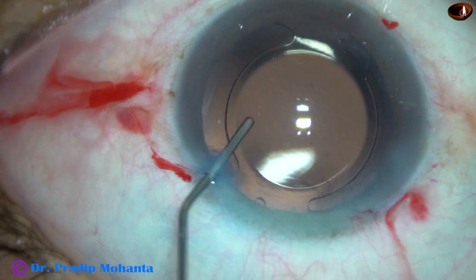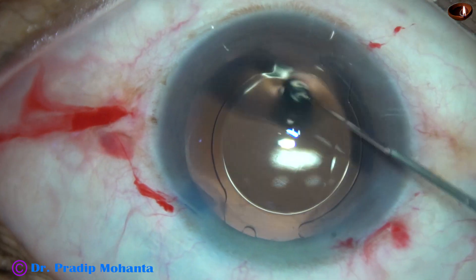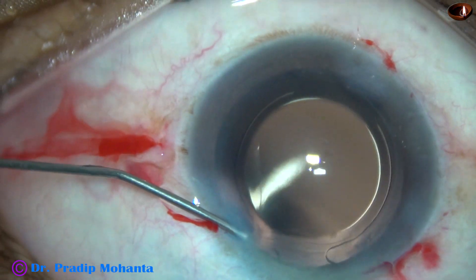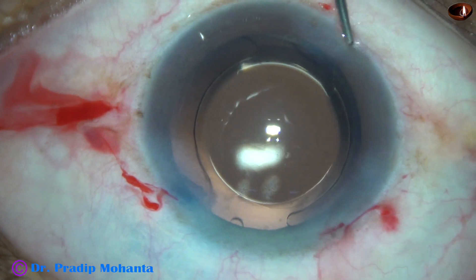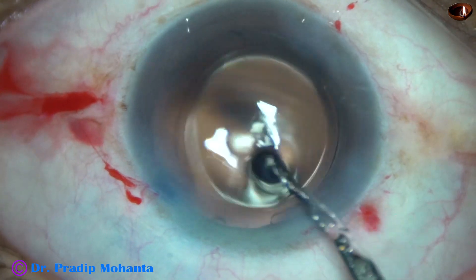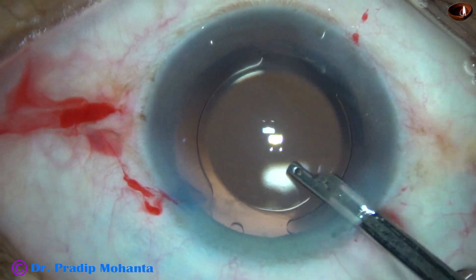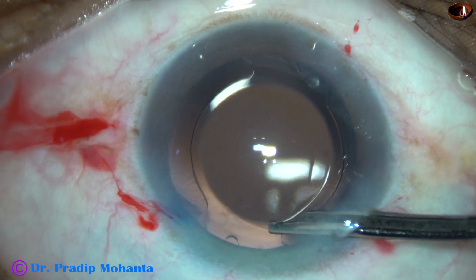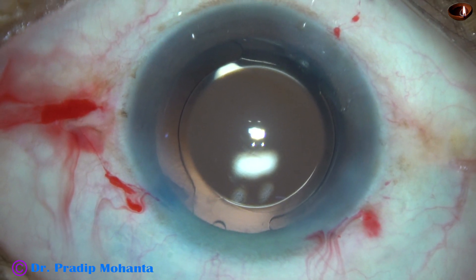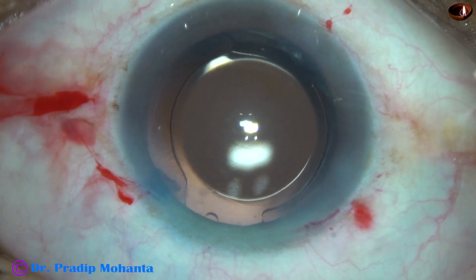And now this is a bit of moxifloxacin. The side ports are closed by hydrating the corneal stroma with BSS. And now this is the final lavage with Simcoe — a gentle stream of BSS is directed towards the corneal endothelium through the aspirating port, flushing out some viscoelastic. Whatever viscoelastic sticks to the corneal endothelium gets removed. The integrity of all the wounds is checked, and a few drops of moxifloxacin are applied over the cornea and the case is concluded.